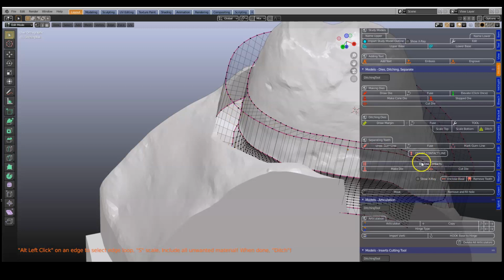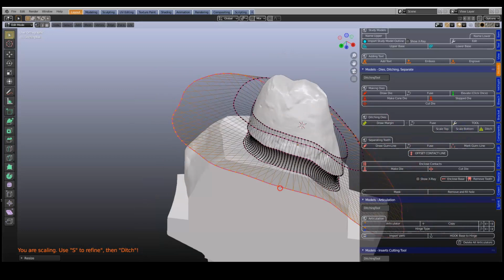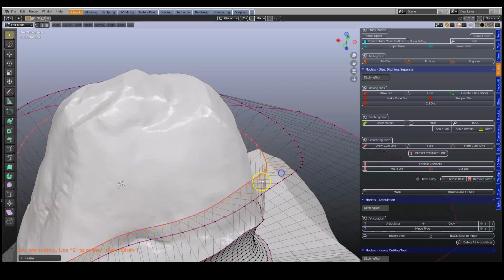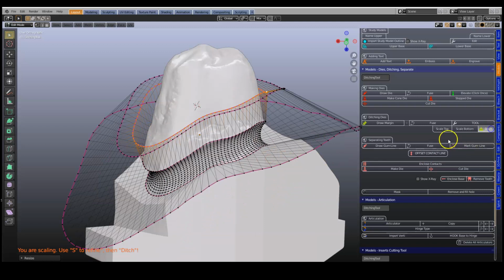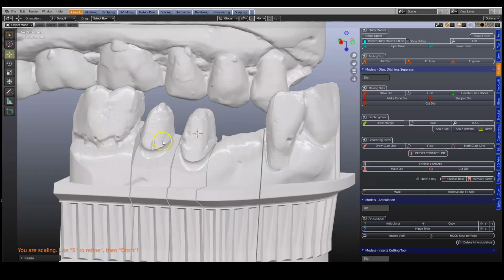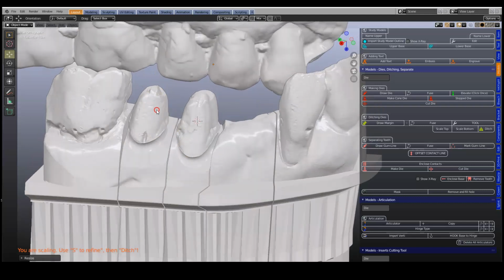Okay, so I'm going to take the top of it, scale, S, take the bottom, scale it out all the way like that. Good. I want to make sure that this one, S, does not hurt my die at all. Okay, that's looking good. And we're going to click on ditch. Excellent. Okay, that's two done. And then you would then do your pontic and your other side to make your bridge. Okay, this one's a bit sharp, so you have to be careful there as well.